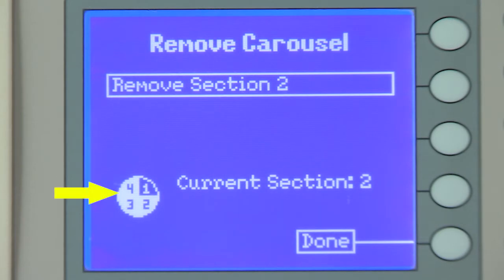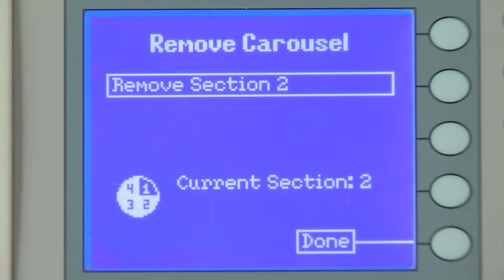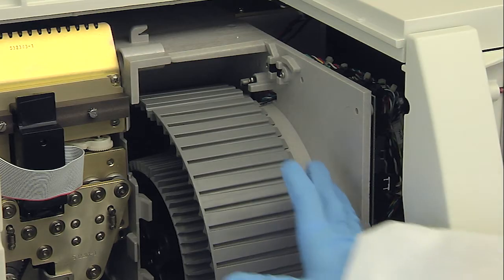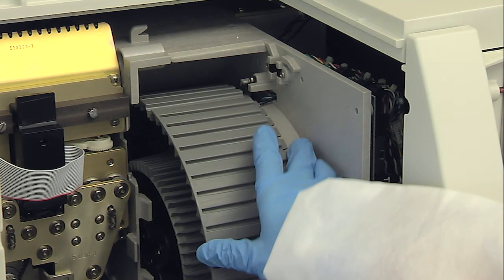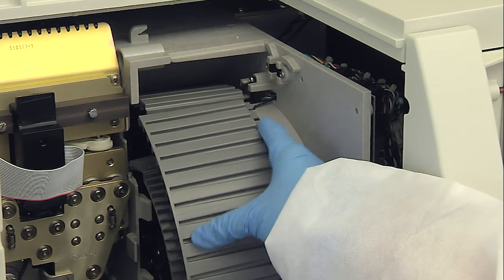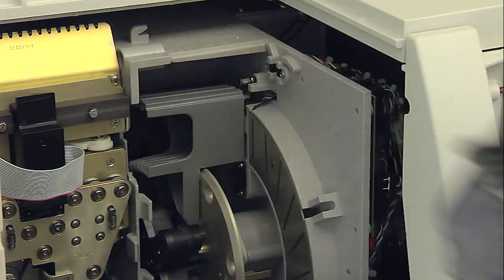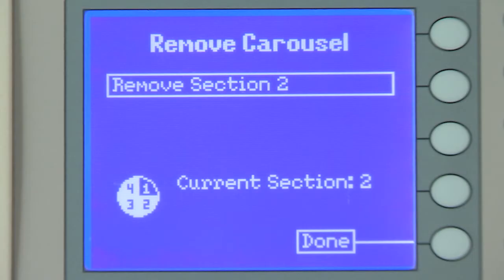The carousel icon on the screen indicates one fewer section. In this example, three of four sections remain on the carousel. When the message Remove Section 2 displays on the screen, grasp the second carousel section, tilt it to the left, and pull it up and away from the instrument.